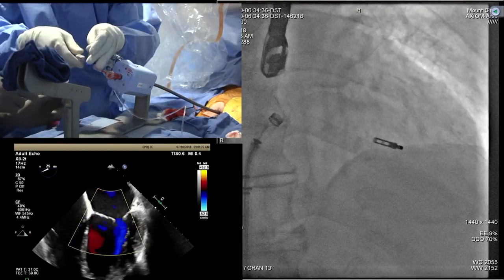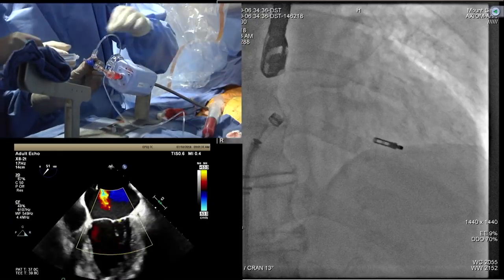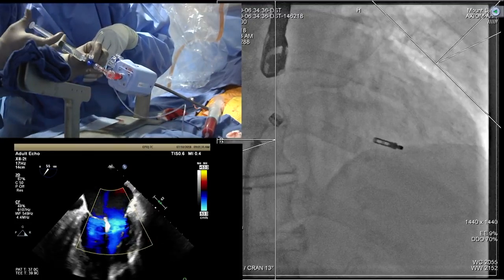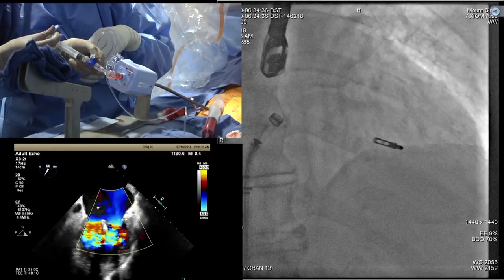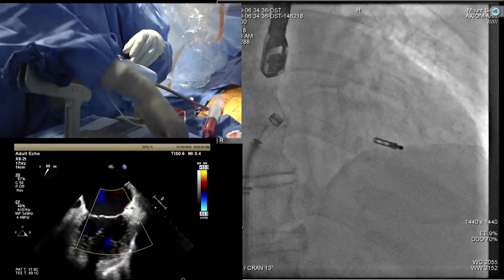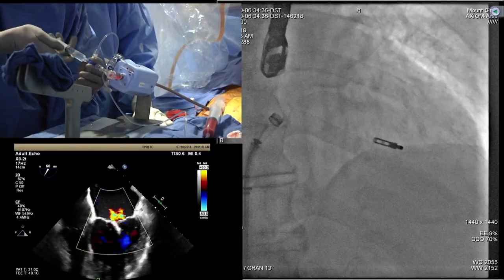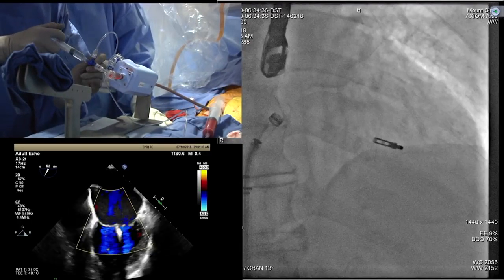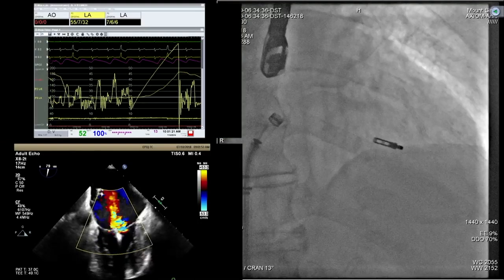Okay, good. Excellent. Let's look at the pressure now. You want to flush? No, I want to flush. So there's no blood at all. Okay, good. Show me the pressure. Final now. Where are we again? Because many times what happens is when you have the delivery system, you could have some damped pressure, and now everything is flushed and nice. And where are we?